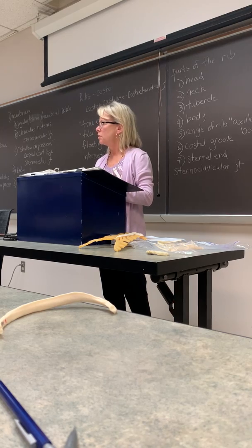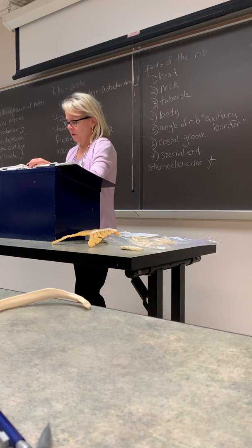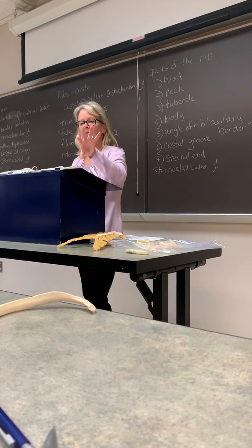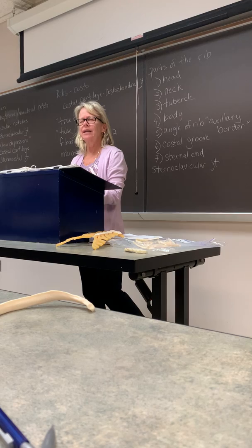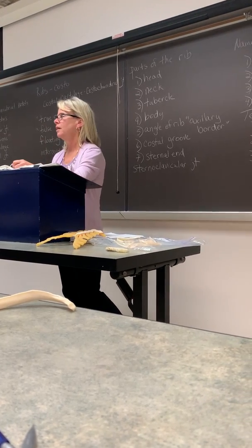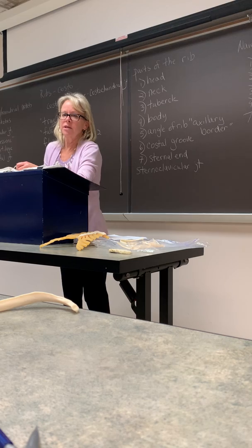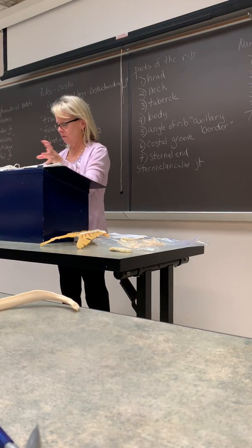You said 30 inches SID? They might not talk about that much anymore because they're trying to do away with that 30-inch SID. What does 30-inch SID do? We just had that with something. Oh, that's right. What does it do? Magnifies it, okay. It'll magnify it, and sometimes it'll blur things out that you don't want to see because of the magnification.